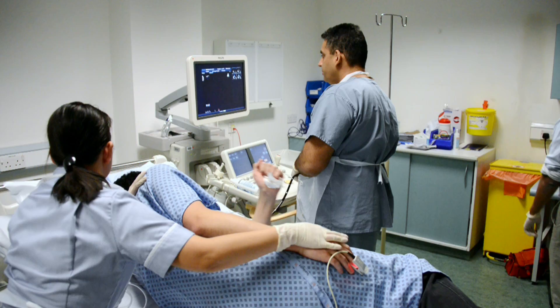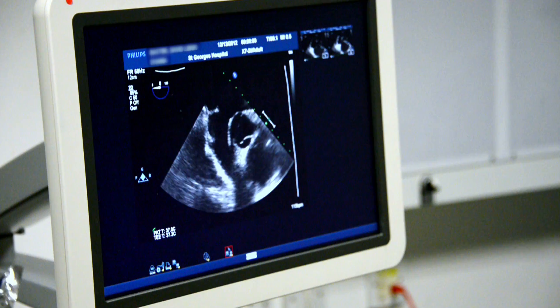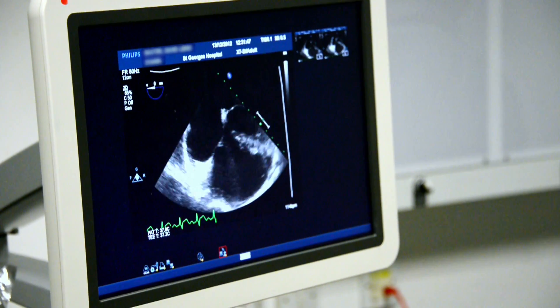This film will show you what to expect if you are having a trans-oesophageal echocardiogram, often called a TOE.